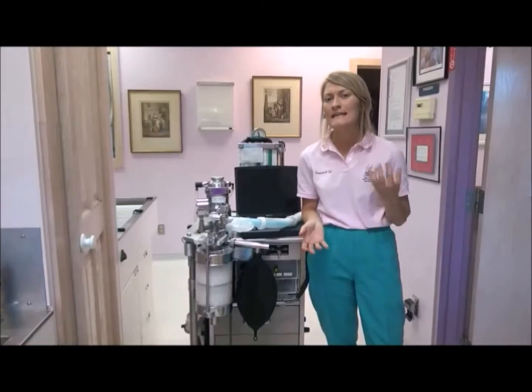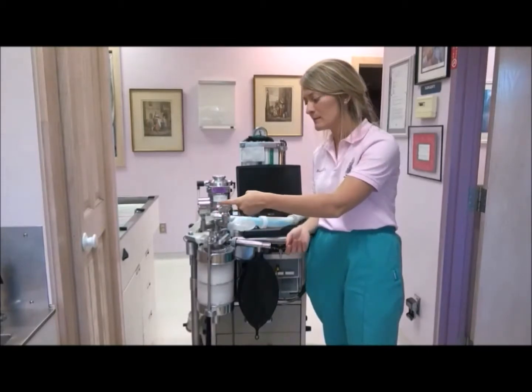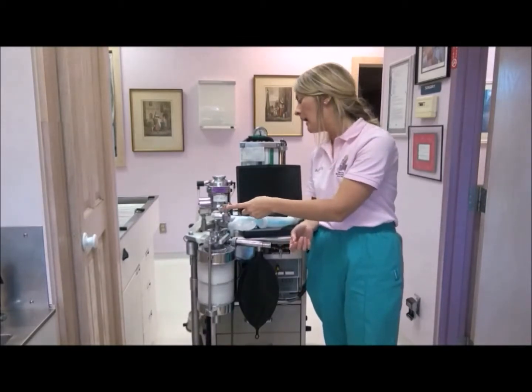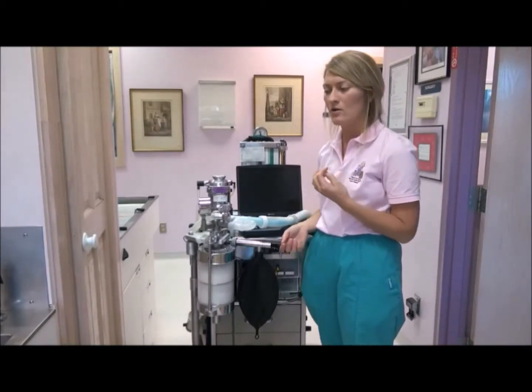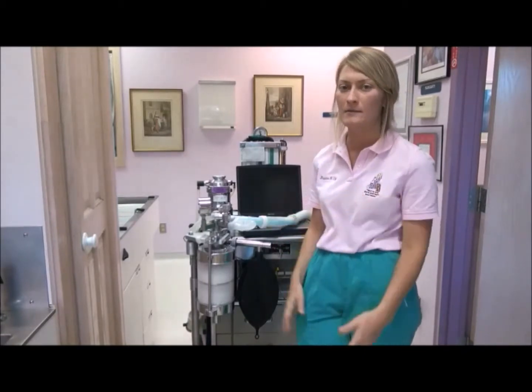If you're using a non-rebreathing system, there would be no CO2 canister, no pressure manometer, no unidirectional valves, and occasionally no pop-off valve. With the non-rebreathing system, they use high rates of oxygen flow, so that's why a lot of times they're recommended for patients who are under 7 kilograms of body weight.